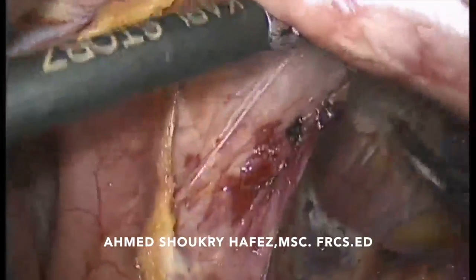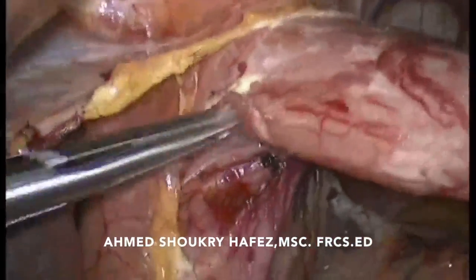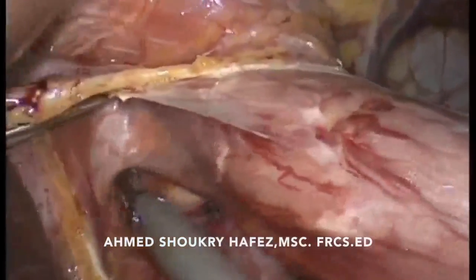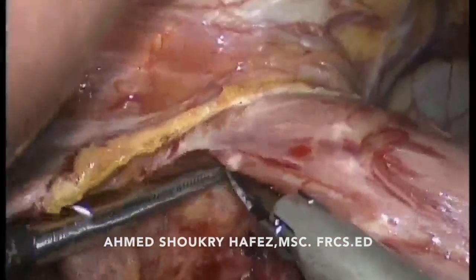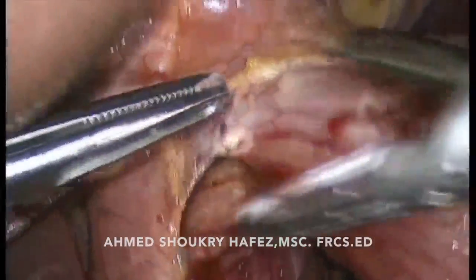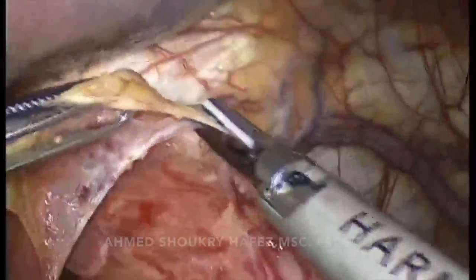We need at least 2 or 3 centimeters of a relaxed, non-tense intra-abdominal esophagus. This is very important for the success of the surgery. So we gradually dissect all the periesophageal attachments so as to gain length in the intra-abdominal esophagus.